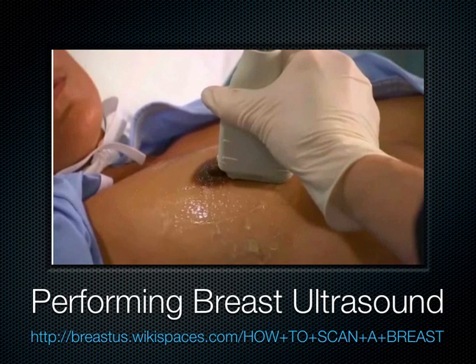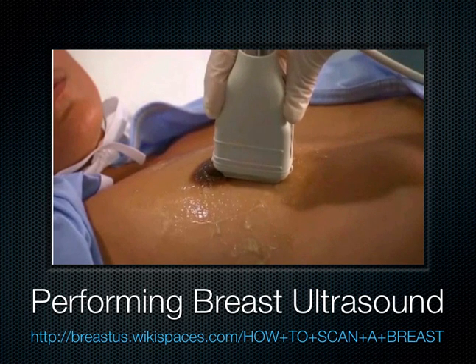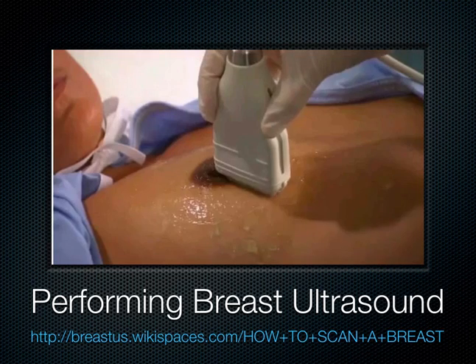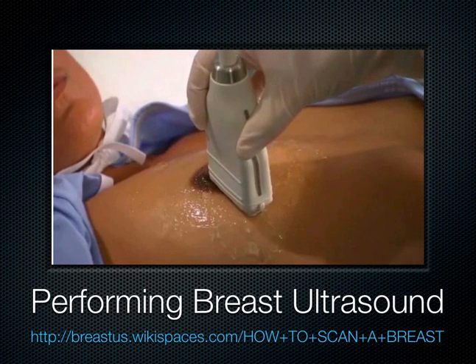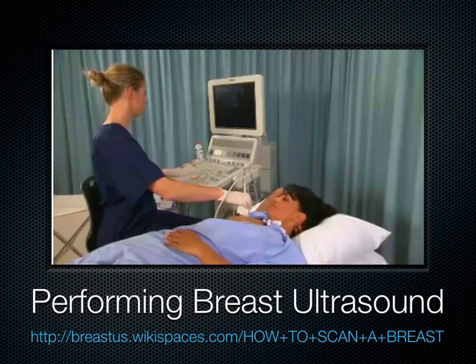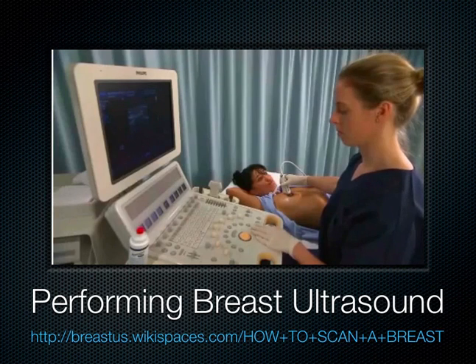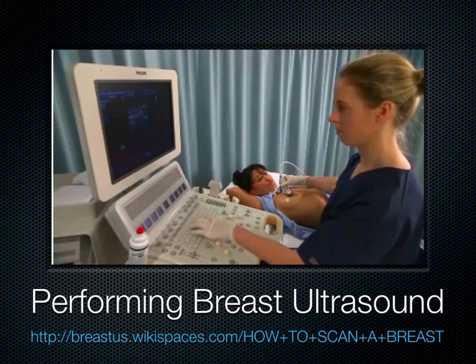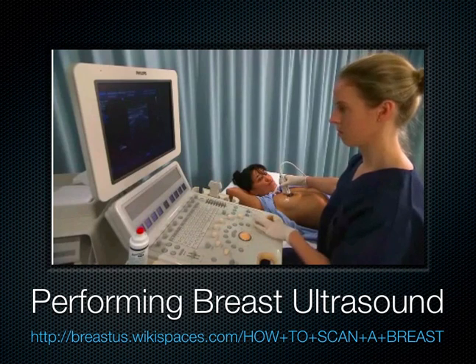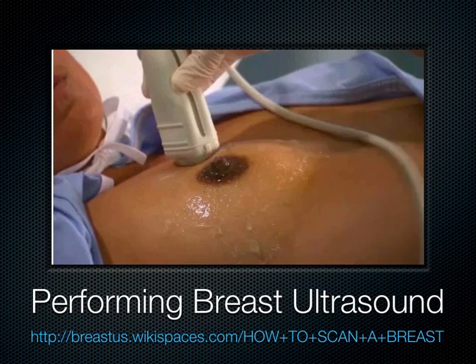After obtaining an image at the 6 o'clock position, reorientate the transducer so that the notch faces away from the nipple. Continue to scan in a clockwise direction, saving annotated images at the 7, 9, and 10 o'clock positions. If the entire breast has not been viewed completely during the first radial scan, a second radial scan may be required to image the outer zones of the breast.